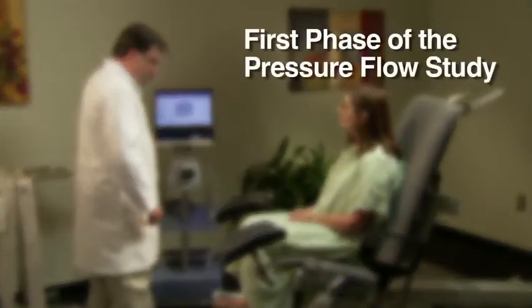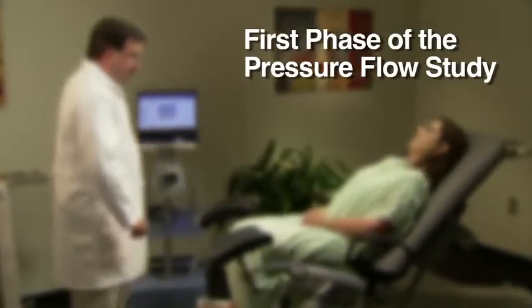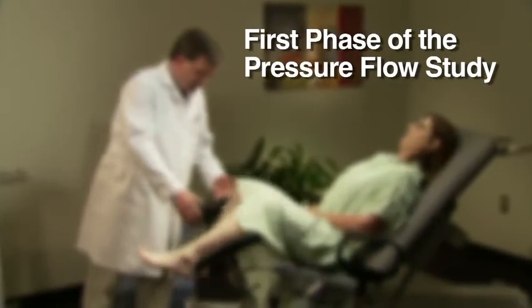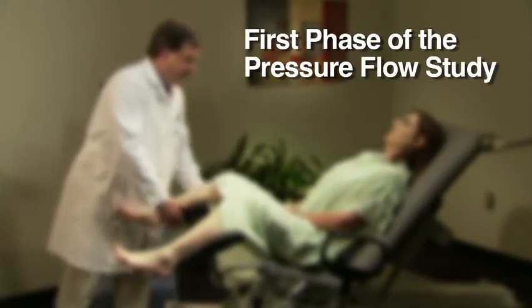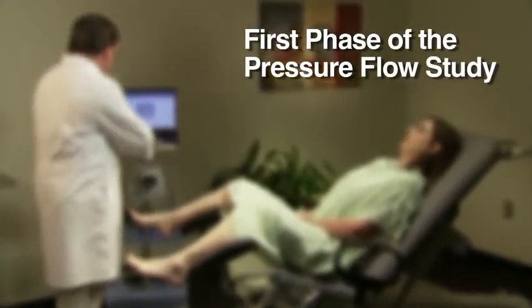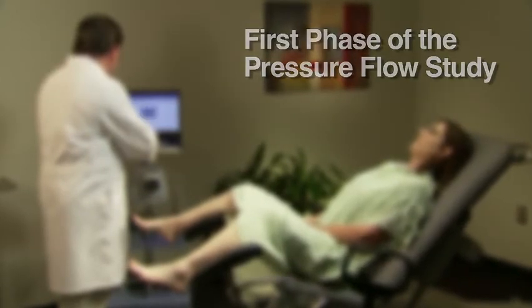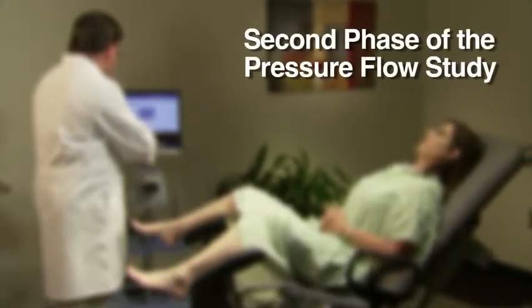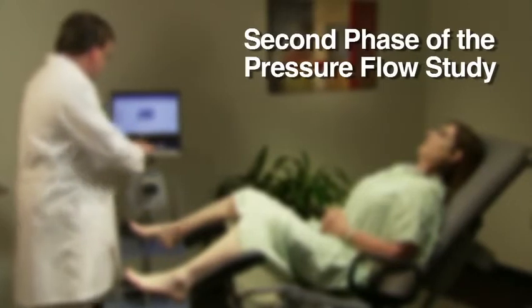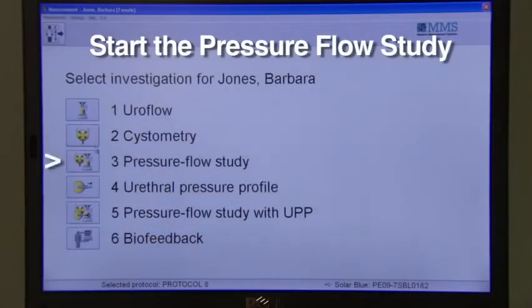While the bladder is filling, the technician will assess the patient's ability to store urine by monitoring filling sensations. The technician will also try to replicate the patient's everyday urinary symptoms of obstruction, stress incontinence, or urge incontinence. In the second phase of the pressure flow study, the technician will ask the patient to empty her bladder as naturally as possible, with catheters remaining in place to measure pressure changes while the patient voids.